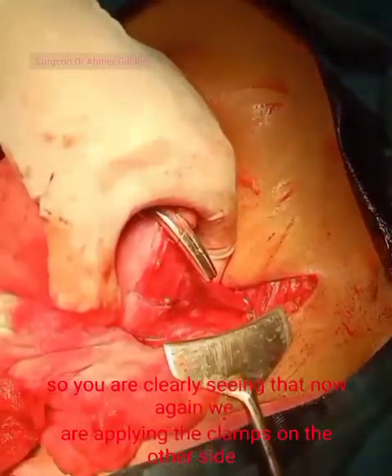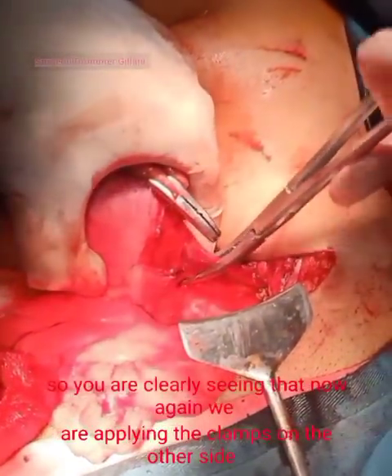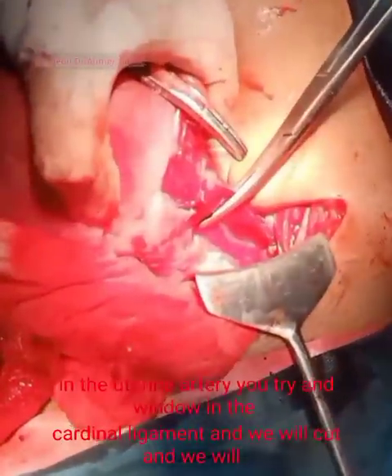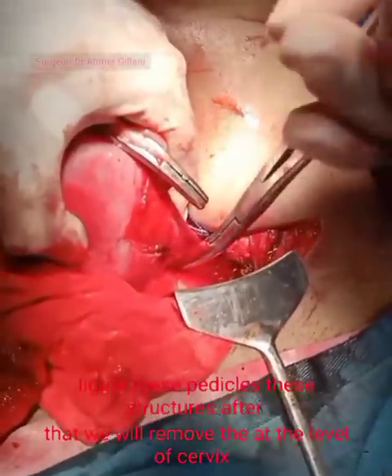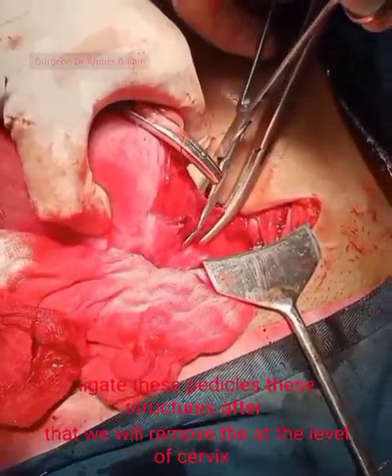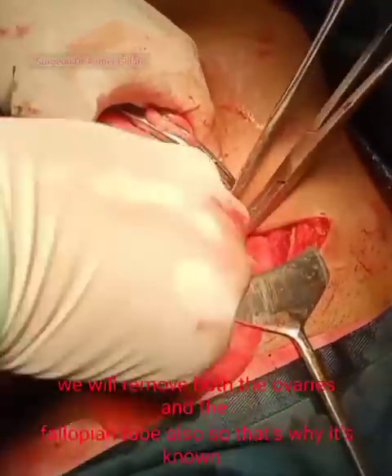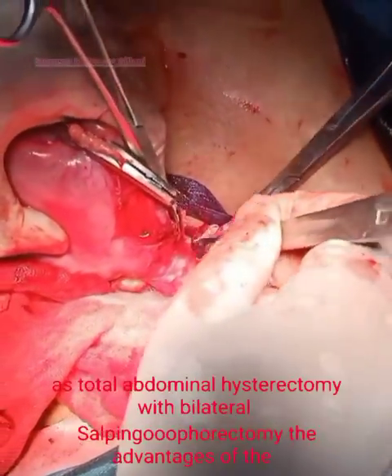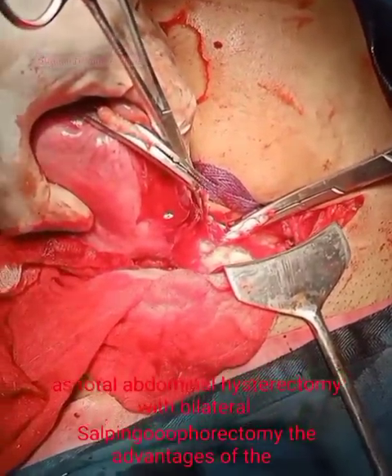On screen, we are applying clamps on the other side — the uterine artery and uterine vein in the cardinal ligament — and cutting and ligating these structures. After that, at the level of the cervix, we remove both ovaries and fallopian tubes as well. That is why this is called total abdominal hysterectomy with bilateral salpingo-oophorectomy.